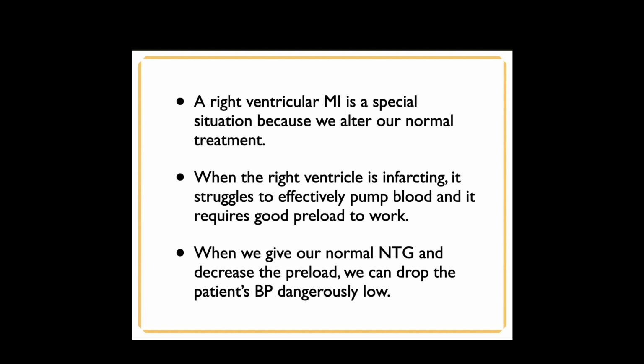Now, in this class, when we talk about change of treatment, we'll say that's our protocol. But if you work in a place like Malco, what they say is, well, I don't want to take the time to move the electrode over to the right side. So we're just not going to give any nitro to anybody who has an inferior STEMI. So that's how they do it there. The time isn't worth it, okay?